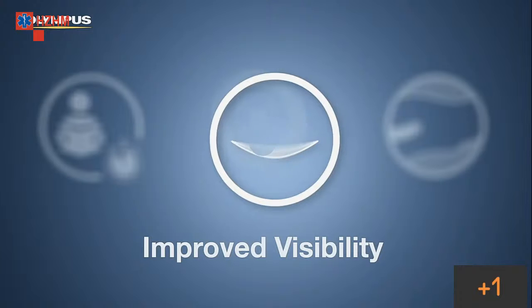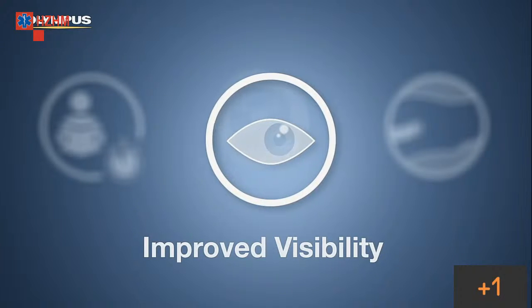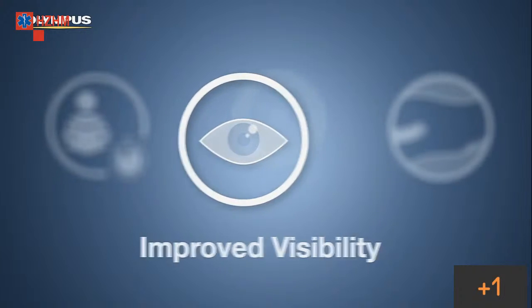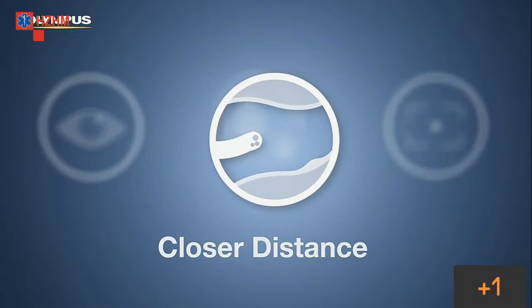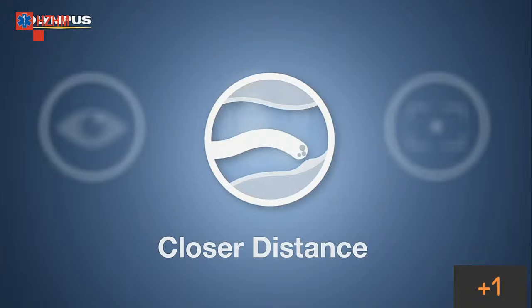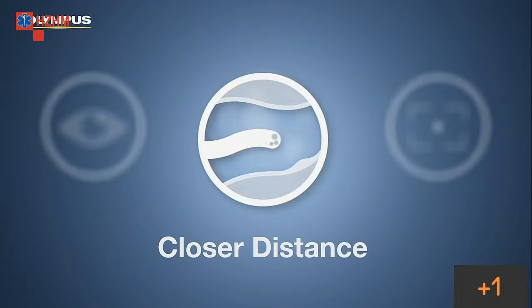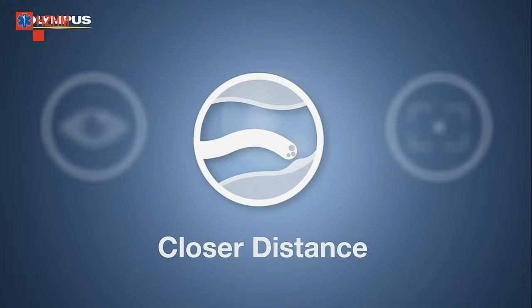EDOF supports the detection of lesions through improved visibility, thanks to a broad focus range and less blurring. EDOF allows for a much closer distance to the object in normal mode compared to previous dual-focus endoscopes. Therefore, EDOF was developed to ease handling significantly by reducing the need to frequently switch from normal to near mode.